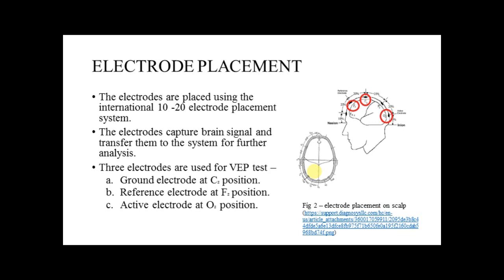Okay, so there is some electrode placement for this experiment. Here in the diagram, as we can see, I marked three positions. First is CZ, second OZ, and third is FZ. How could I place my electrodes in such positions? All of you know about the international 10-20 lead electrode system of EEG? Everybody knows? Okay, so on the basis of that 10-20 electrode system of EEG placement, we use placement parameters like CZ. For the central part we use C, and Z is defining the axis here. Similarly, F is for the frontal lobe, and OZ is occipital.